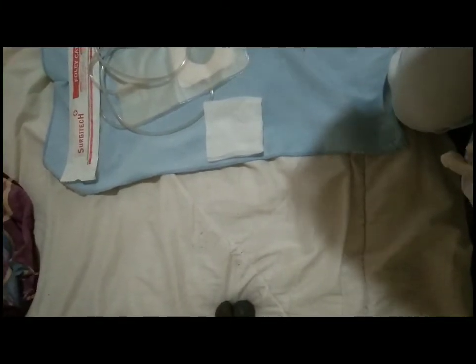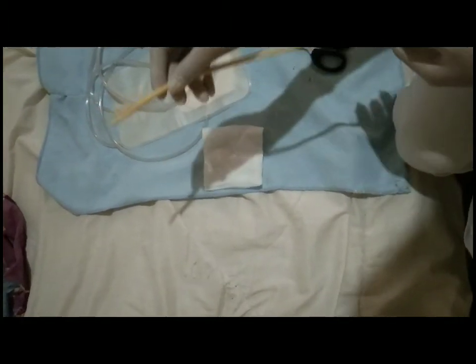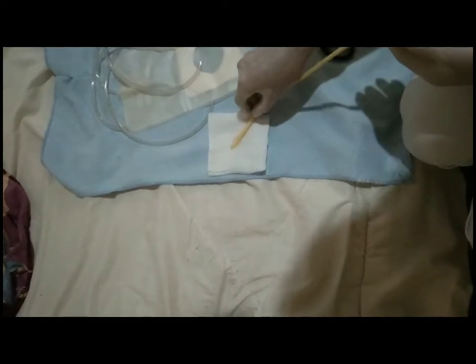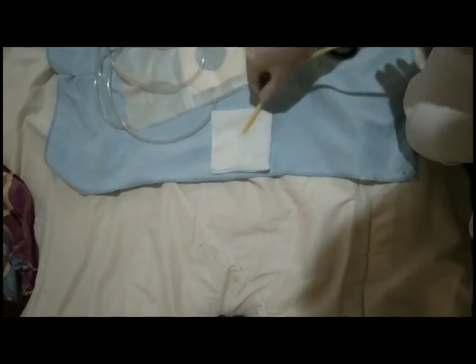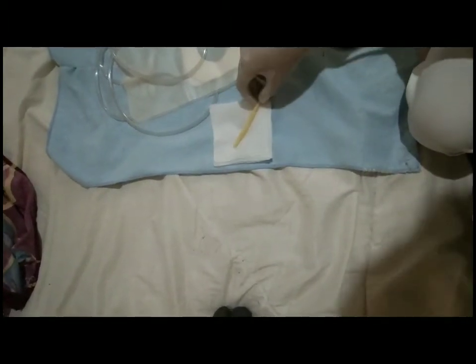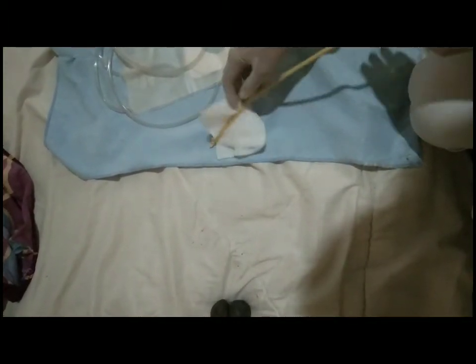So we already put lubricant on the swab, and now we will take the Foley catheter. So here is our Foley catheter. We will put it on a swab. Make sure that the swab is at 6 to 7 inches of the length.